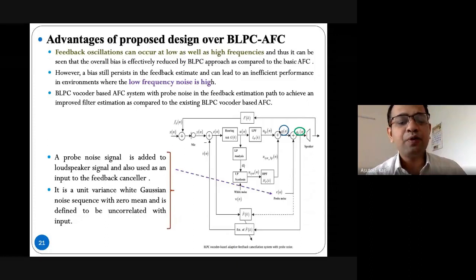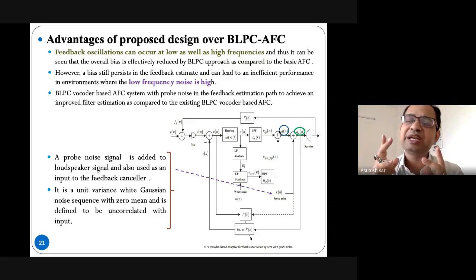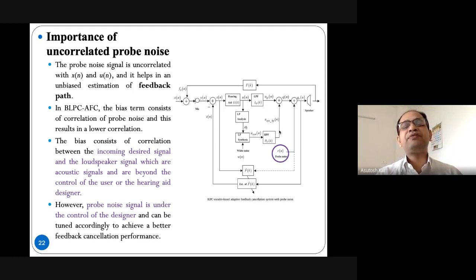And we found the algorithm converges in mean, which is the minimum requirement for any adaptive algorithm. It should converge in mean. Our algorithm converged in mean. The steady state performance we also found quite acceptable. And then we went for writing this research.